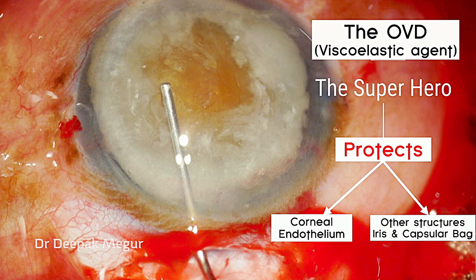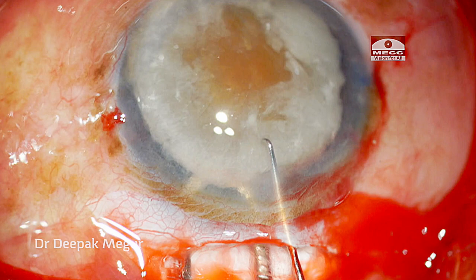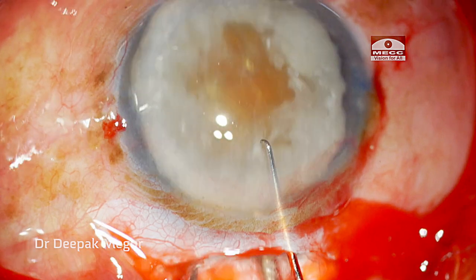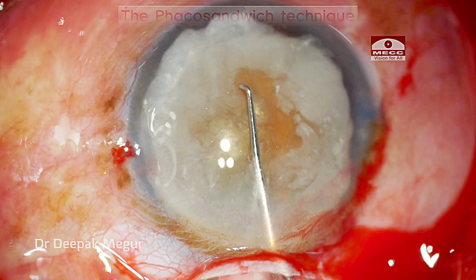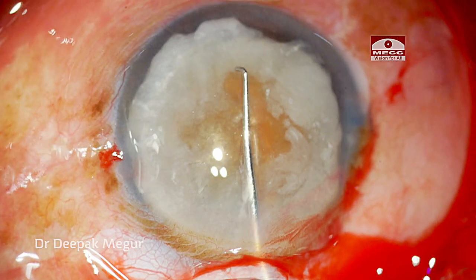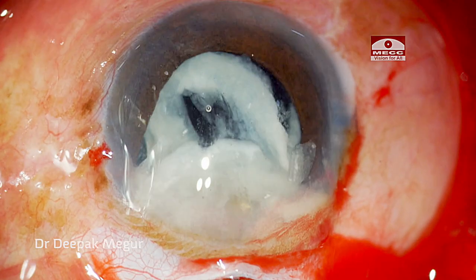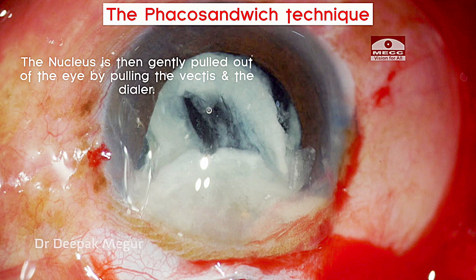Now it's time to perform the nucleus extraction — demonstrating the phaco sandwich technique. The two instruments used are the wire vectus and the lens dialer. The vectus is slid under the nucleus, the lens dialer pushes the nucleus down, and then the entire mass of the vectus, the nucleus, and the Sinski is pulled out through the main incision.